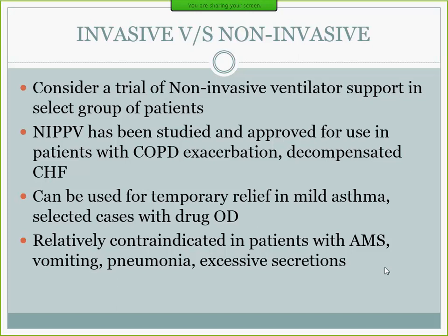So you start with suctioning the patient, take out the mechanical factors that are involving the patient's ventilation, the ventilator circuit, the ET tube, and the most common cause of this high peak airway pressure is airway secretions and mucus plugs. Okay, and that will solve most of your problem, rather than just going up on FiO2.